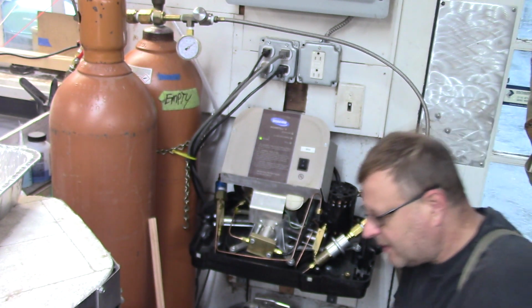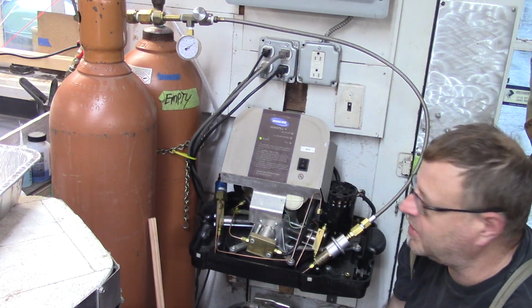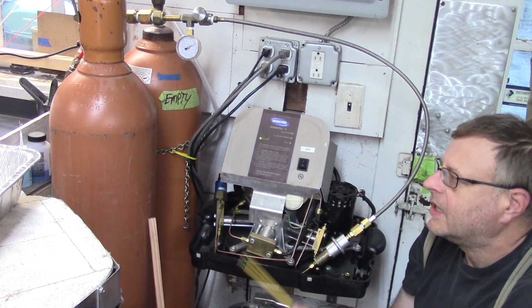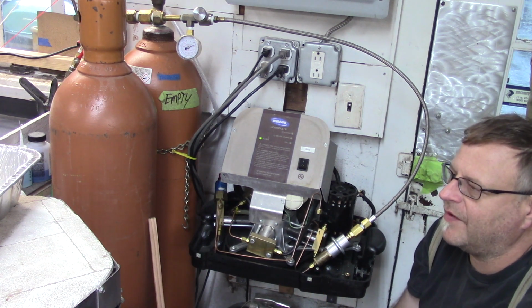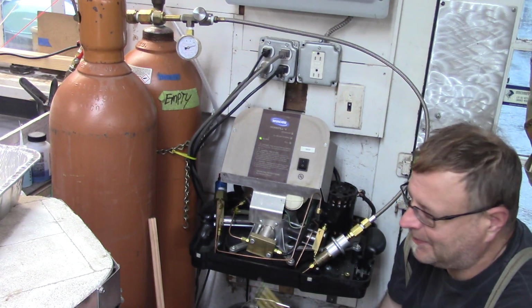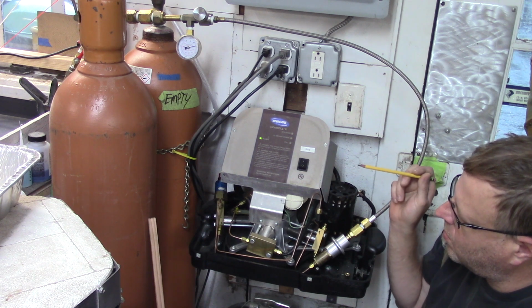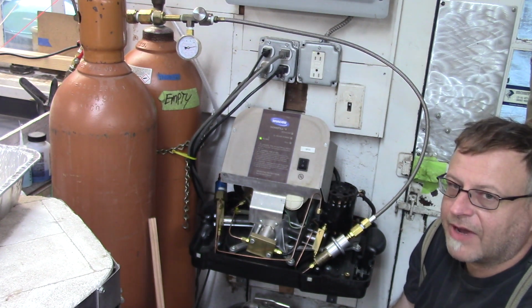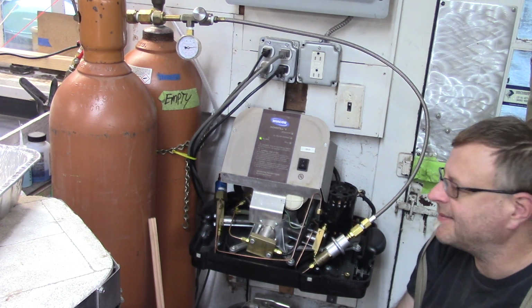So, there you go. It's working. It's absolutely building pressure. It's doing what it's supposed to do. It's just not doing it up to 2,000 PSI. What I normally do is as soon as I start working, I turn this thing on. The best analogy I can come up with for using one of these things is you're filling a 55-gallon drum with a quarter-inch hose. This is 1/8 inch, like 16th inch ID. This is like capillary tubing. But at the bottom of the 55-gallon drum, you have a 1/2 inch hole. As soon as you close that 1/2 inch hole, this thing's still running. So you're running at a deficit all the time, but you are filling it, ever so slowly.